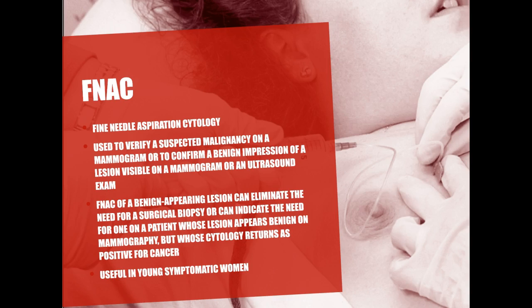So as we talked about in a previous slide, the radiologist is going to take into consideration the age of the patient, whether they're pre or postmenopausal, and what the aspirate looks like when they took it out. Did it look bloody or not? Was it nice and clear? Is the lesion painful? And so forth, to determine whether they want to send that fluid off to pathology or if the referring physician is asking for it to be sent off.